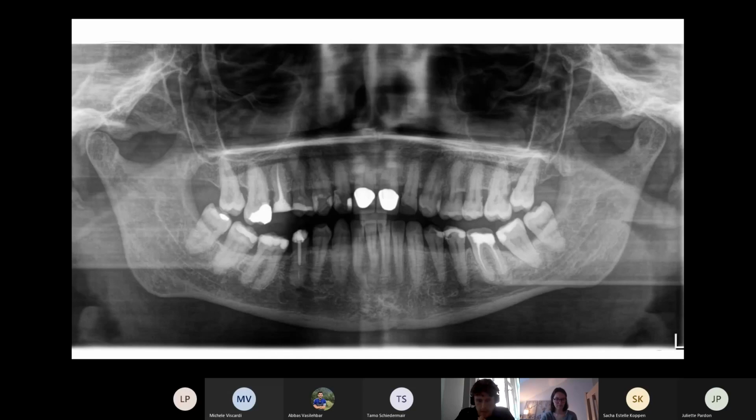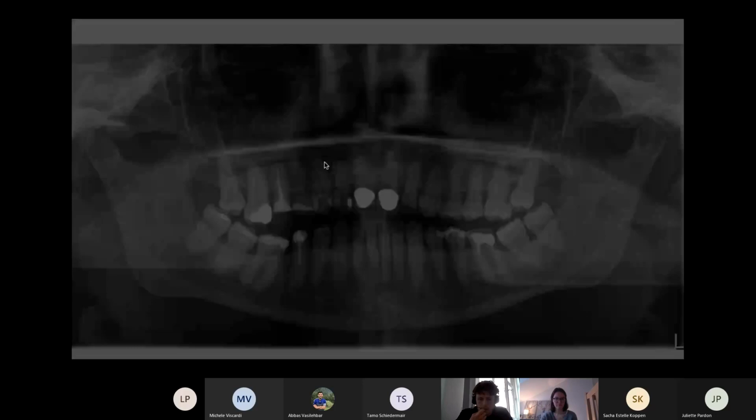Number 5, it's endo treatment, and it's hard to see because some composite material is sometimes not very visible in the X-ray. It depends a little bit on the type of composite material. So either there is simply no restoration of the crown yet, or maybe it broke, or there is actually one and it's just not visible on the X-ray.